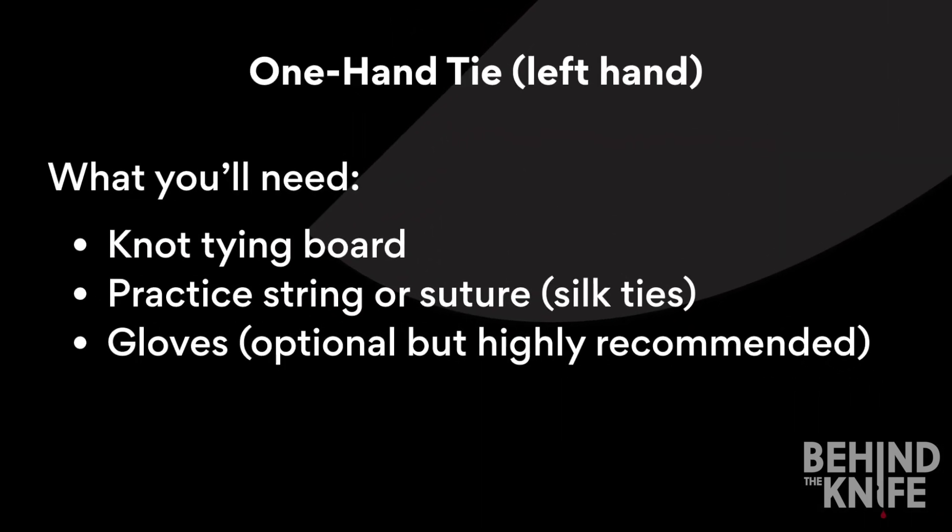Today we're going to review how to do a one-handed knot tie. For this we'll need our knot tying board, our practice string or suture — silk ties work best — and gloves are optional but highly recommended.